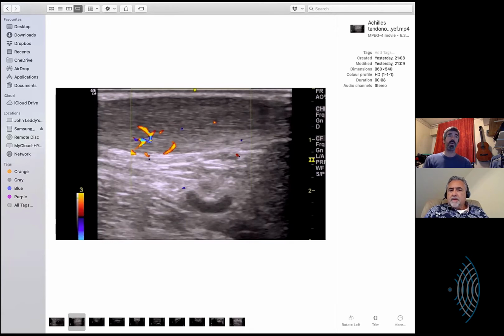However, when I talk to my patients, there seems to be quite a strong correlation between their symptoms, the currency of their symptoms, and the amount of vascularity. To the point where what I do routinely is I scan something with a patient who told me, usually complained quite a lot, about the pain in an area. And then I scan them and I see the pathology, as you do in this case. But I don't see very much color flow in it.